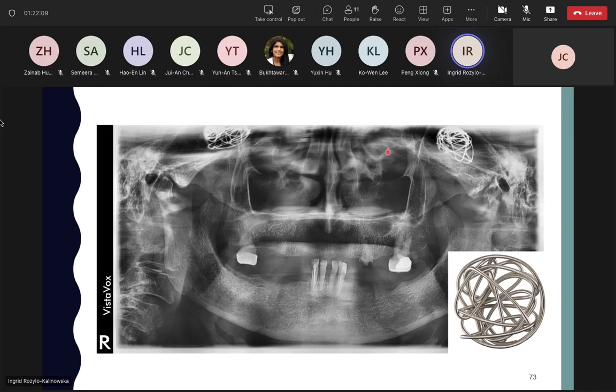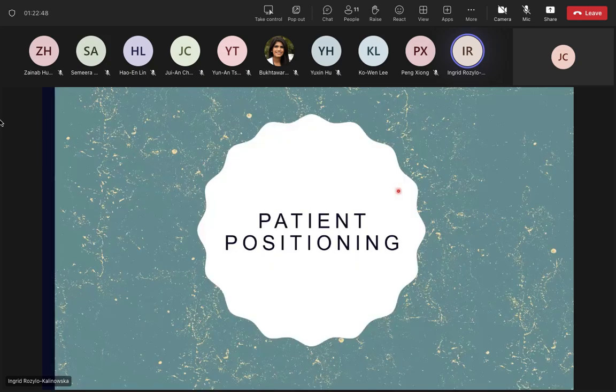And in this case, a patient following such treatment, you can see two images, but this is not true. There was just one aneurysm and one place where all the coils were packed, but it was in such a location in relation to panoramic radiograph that it produced two real images, just like also epiglottis produces two real images on both sides of the radiograph.